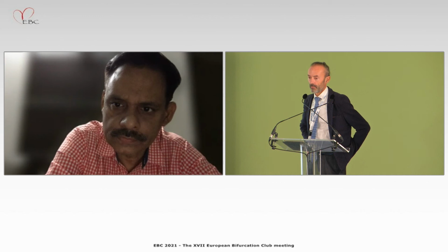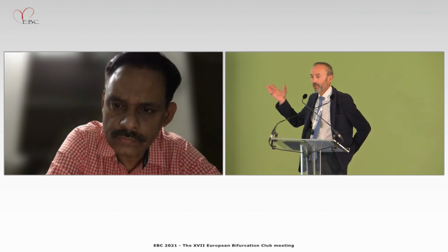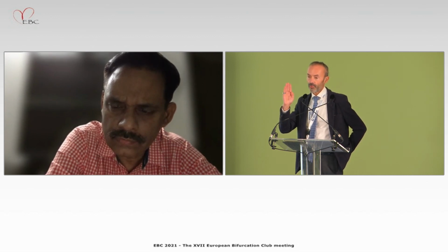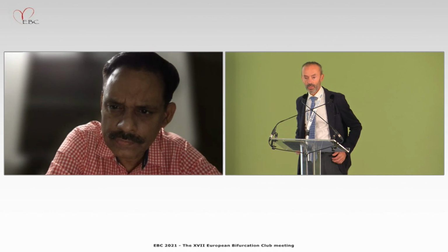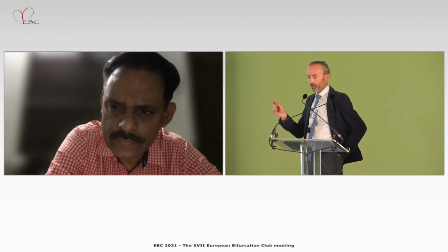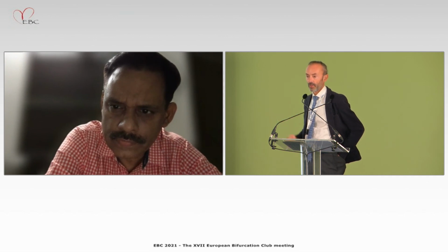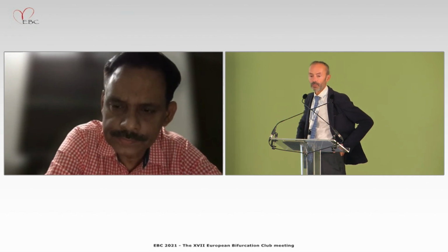Yeah, that's the main question. It depends on the anatomy. In this case, for example, it's a bifurcation 0-1-0. There was some space to do the precise positioning, so I did OCT-guided precise positioning with the huge circ. The problem is that you should pay a lot of attention not to protrude into the circ, but if there is some space, sometimes.